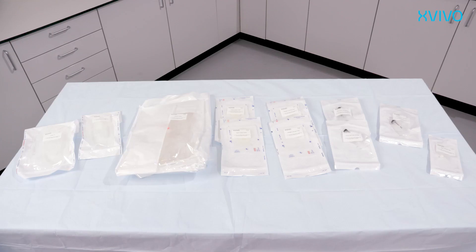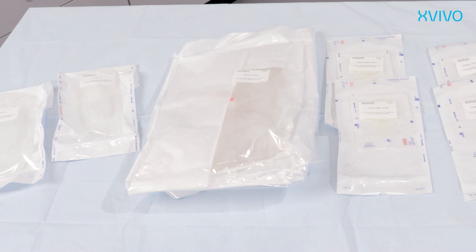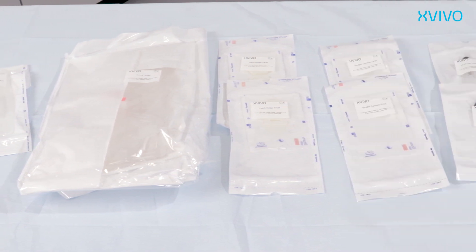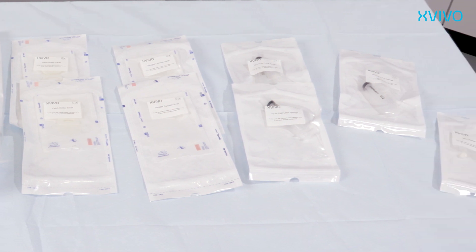The disposable pack also contains the following items: inner lid, outer lid, kidney holder, patch holders, cannulas, syringes, and sterile caps.